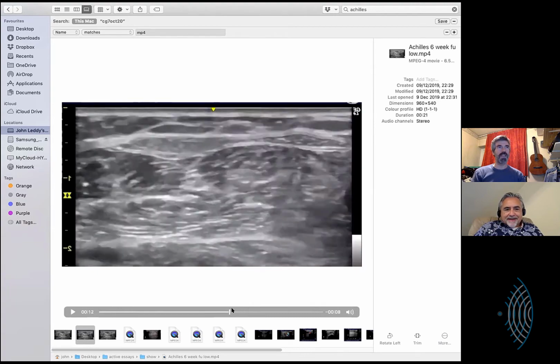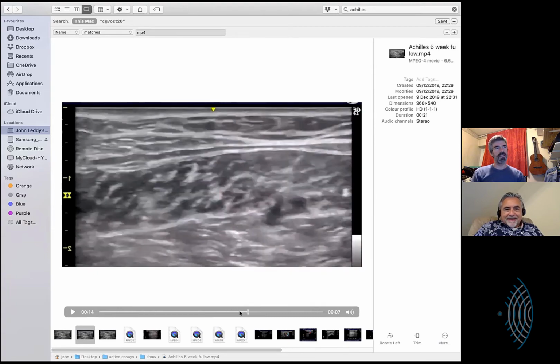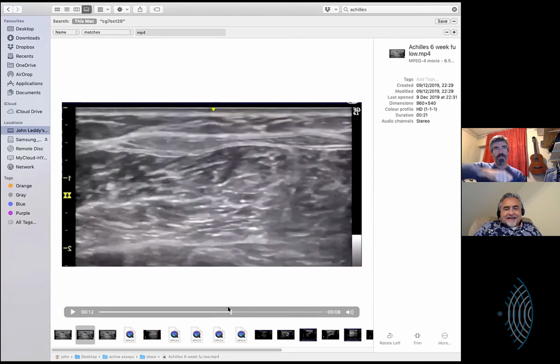But you're looking for that sense, and when you're in a muscle, that's what I do. I run the probe over in short axis, and I get a sense of where things are going. And if I'm following a muscle and I'm in short axis, but the fibers are running in a different direction, you can turn and follow them. But sometimes, if you are following the muscle already, but they're going sideways across the screen, that's telling you where, because they're almost like airplanes flying in, and they're all joining in to where the tendon is forming.